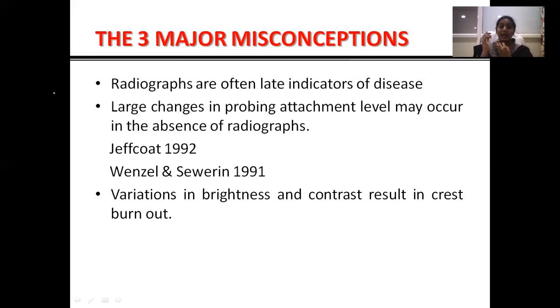Another one is, we state that large changes in probing attachment level may occur in the absence of radiographic change. That means we state that even though there are large probing depths, this change is not noted in the radiographs. So this is also false. Jeff Cote has stated that it is not a problem with the radiographs, but a problem with the clinician's eye, which is not able to appreciate the details that are seen on the radiographs. He states that better imaging modalities, especially digital intraoral radiography, in which you can zoom in and zoom out or adjust the contrast and brightness, will help us in better appreciating the details.